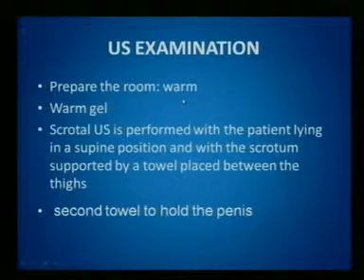Regarding the equipment of the ultrasound, we need to prepare the room, and it should be warm to avoid the cremasteric reflex, especially in children, and to warm the gel. And the scrotal ultrasound is performed with the patient lying in the supine position, with the testicles supported by a towel in the upper thigh, and a second towel to hold the penis.